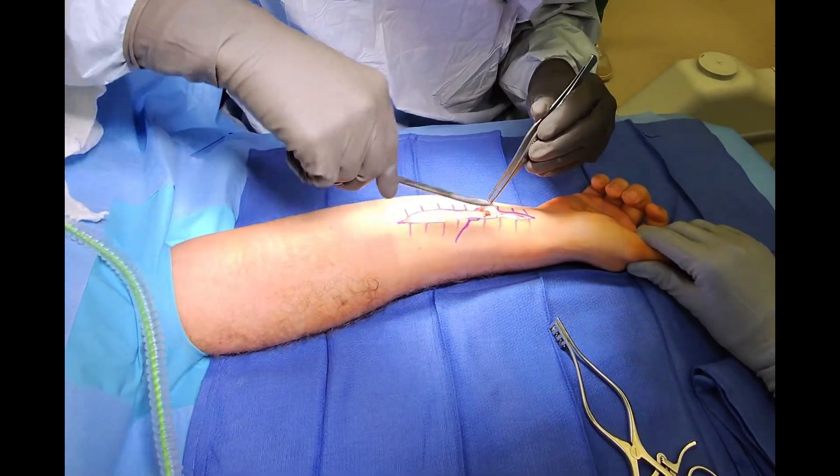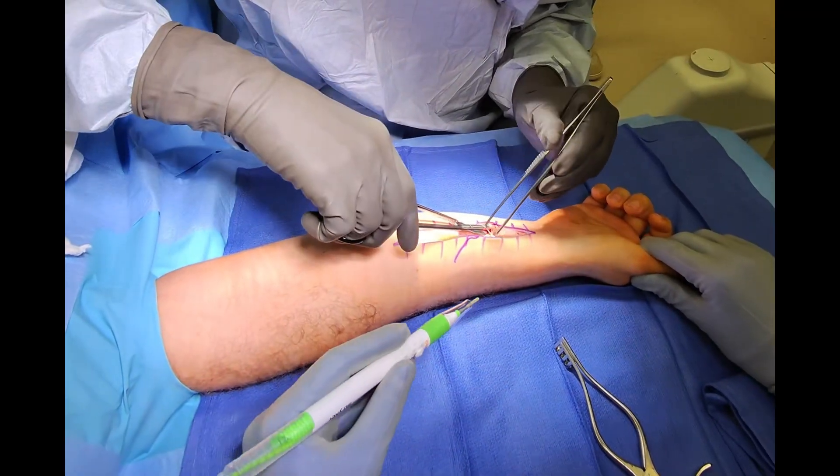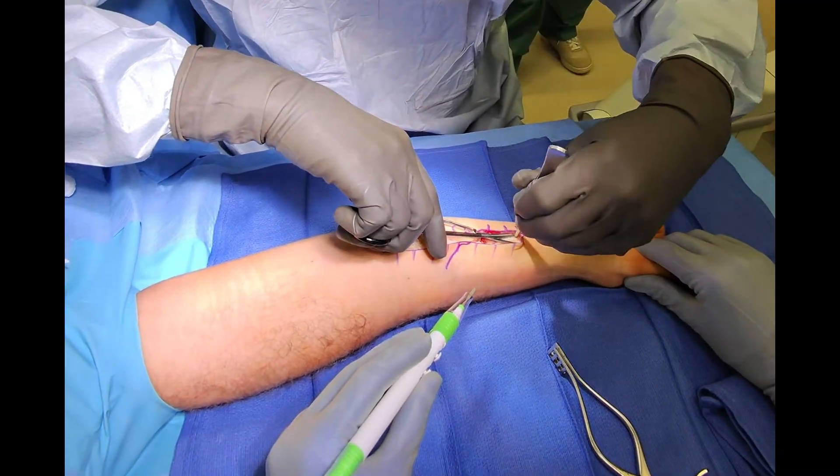We use tissue scissors and an electrocautery knife for our dissection through the subcutaneous layers. The electrocautery knife cuts through tissue while also cauterizing blood vessels so that we can minimize bleeding during the procedure.